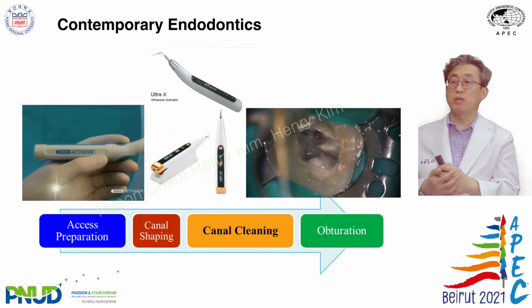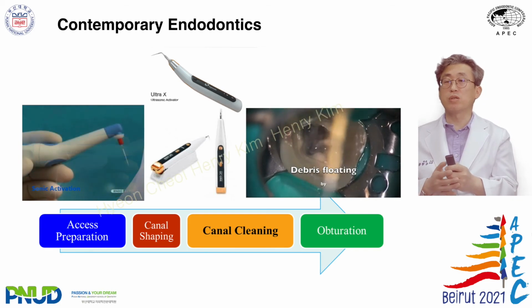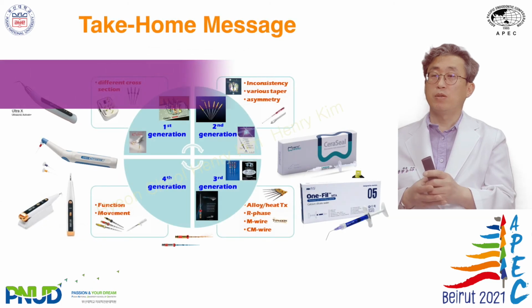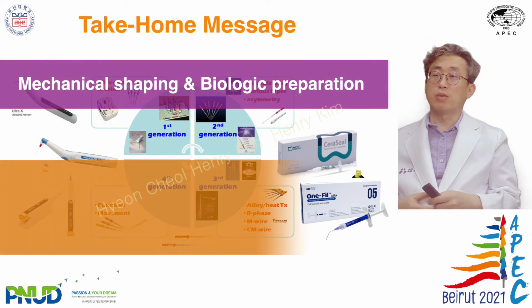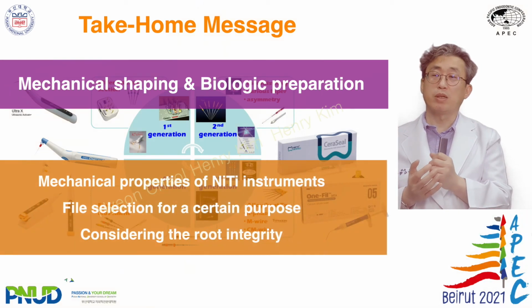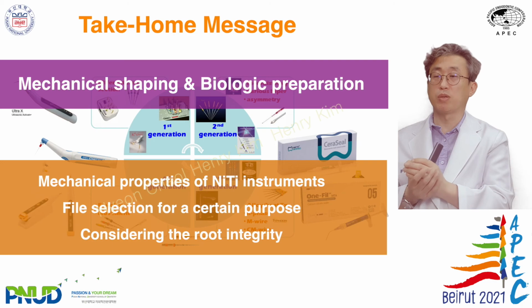For this, we can use sonic and ultrasonic irrigation systems. We all know that not only mechanical shaping, but also biologic or chemical preparation is important.